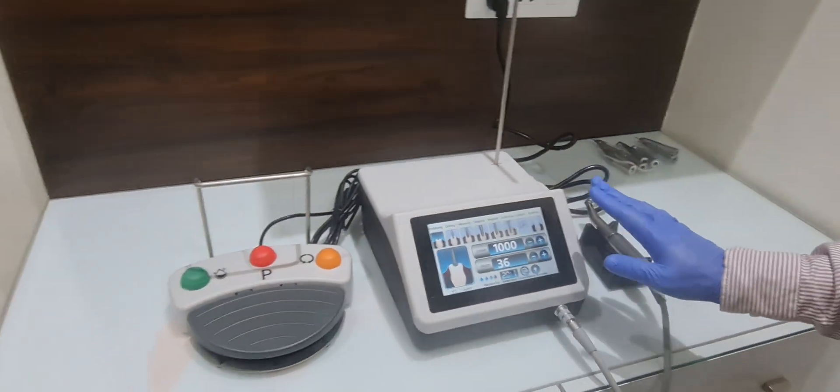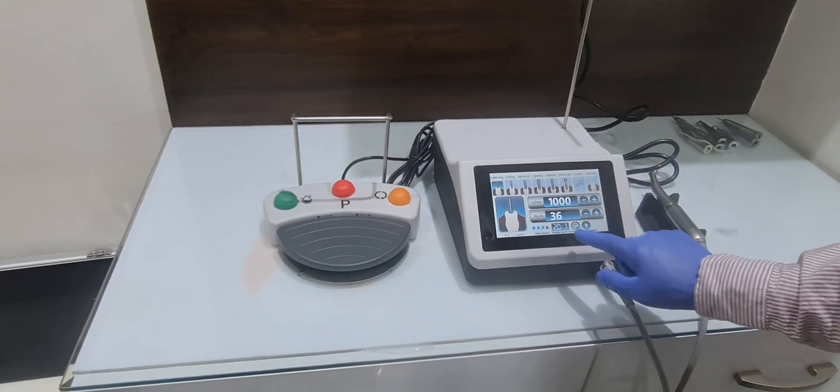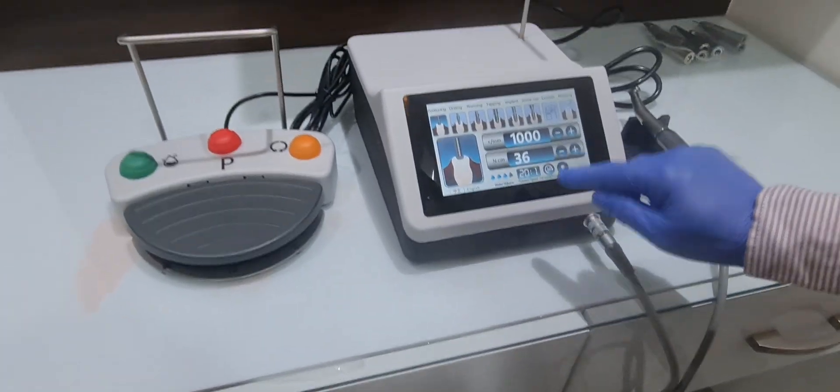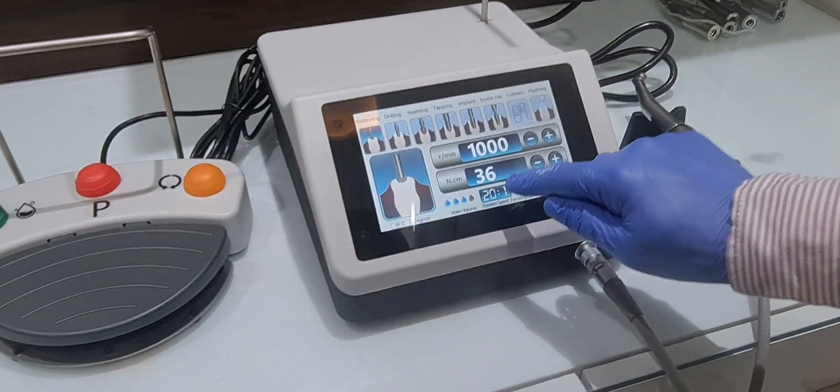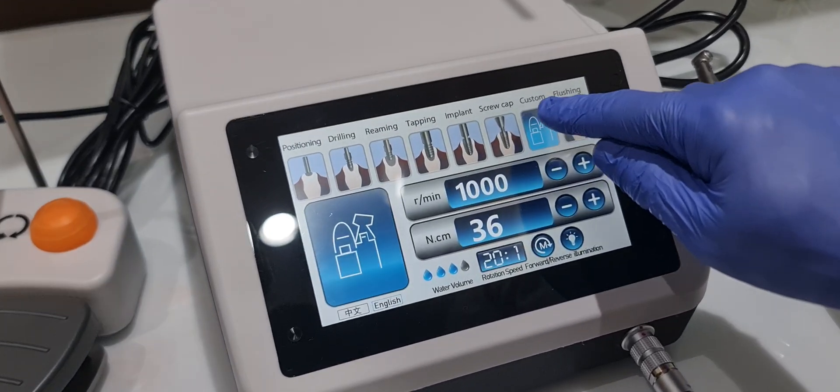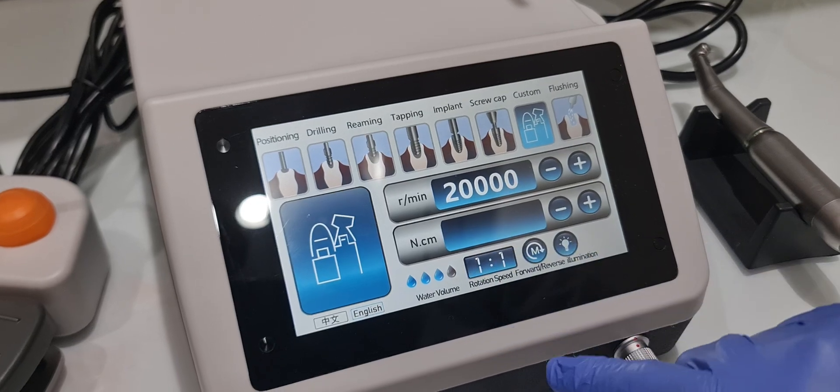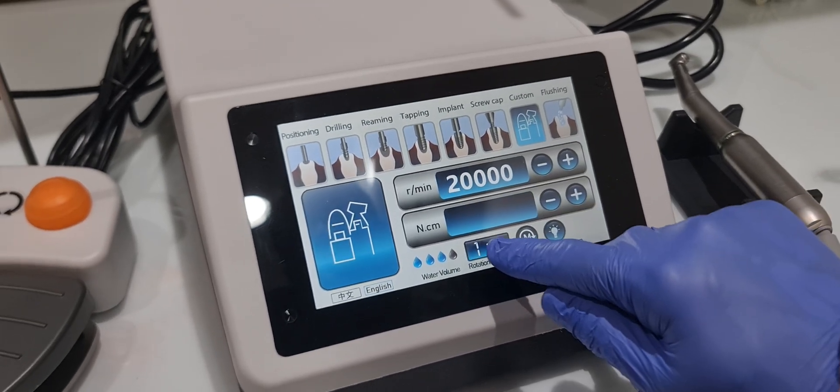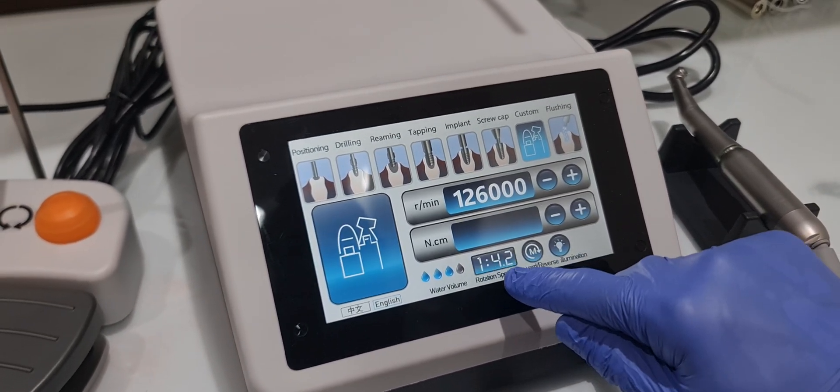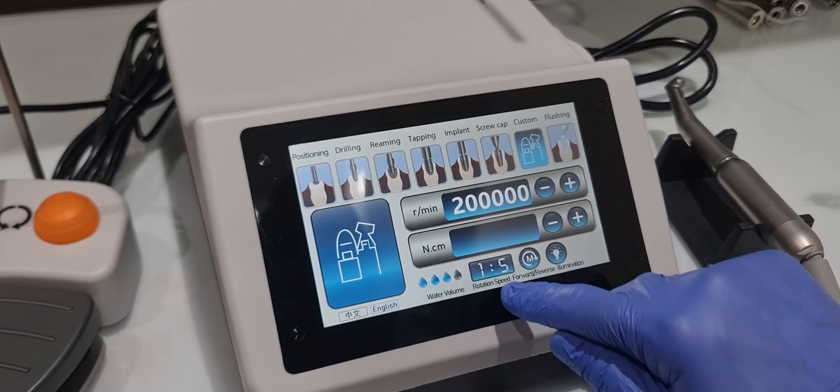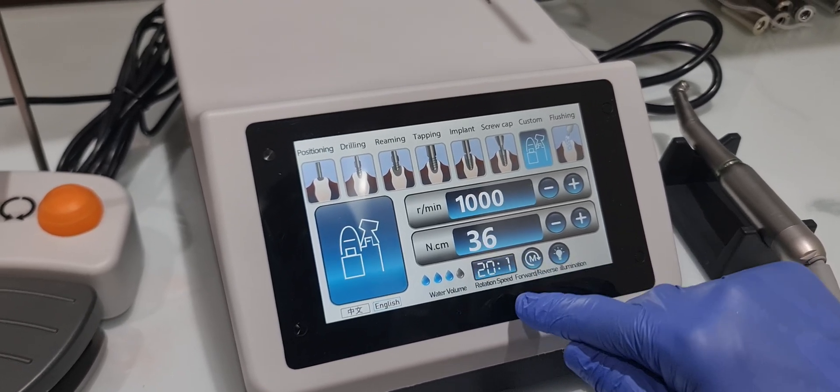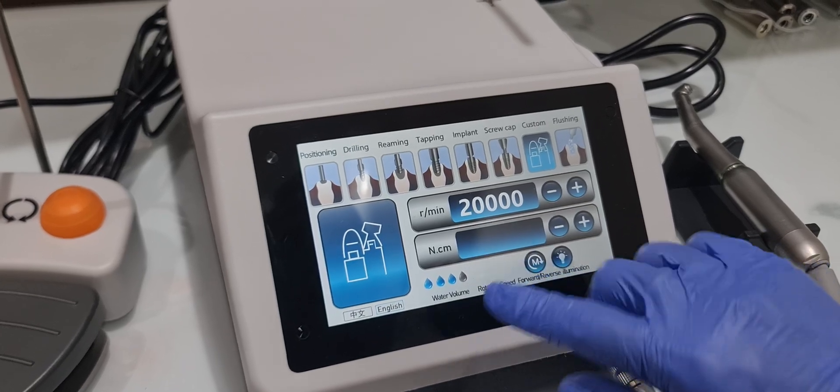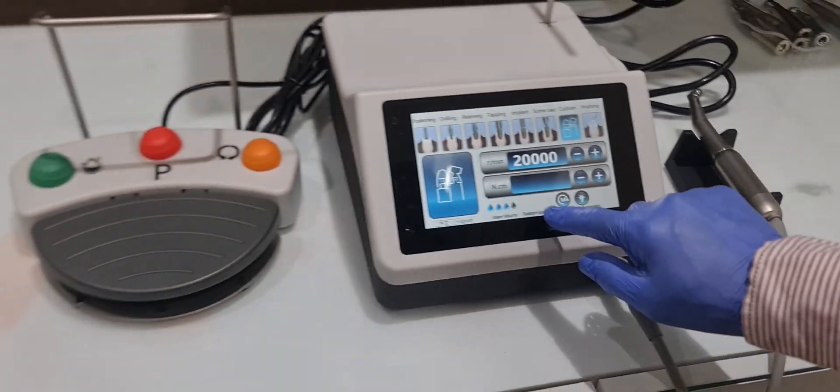Now it has multiple options. First of all, I will show you how many types of handpiece you can attach with this. Press this custom settings. You can see 1:1, 1:4.2, 1:5, 16:1, 20:1.